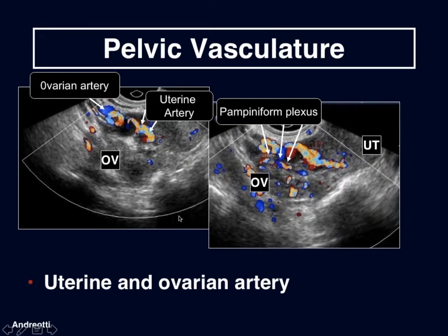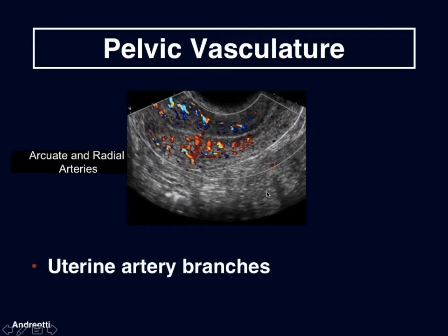Here's a sonographic transvaginal image showing these vessels — the uterine artery along the side of the uterus, the ovarian artery coming from the region of the side wall, meeting here and forming the pampiniform plexus that feeds the ovary. The uterine artery also provides branches which pierce the myometrium and divide into anterior and posterior arcuate arteries. From these arcuate arteries arise branches which penetrate deeply into the myometrium, forming radial arteries.